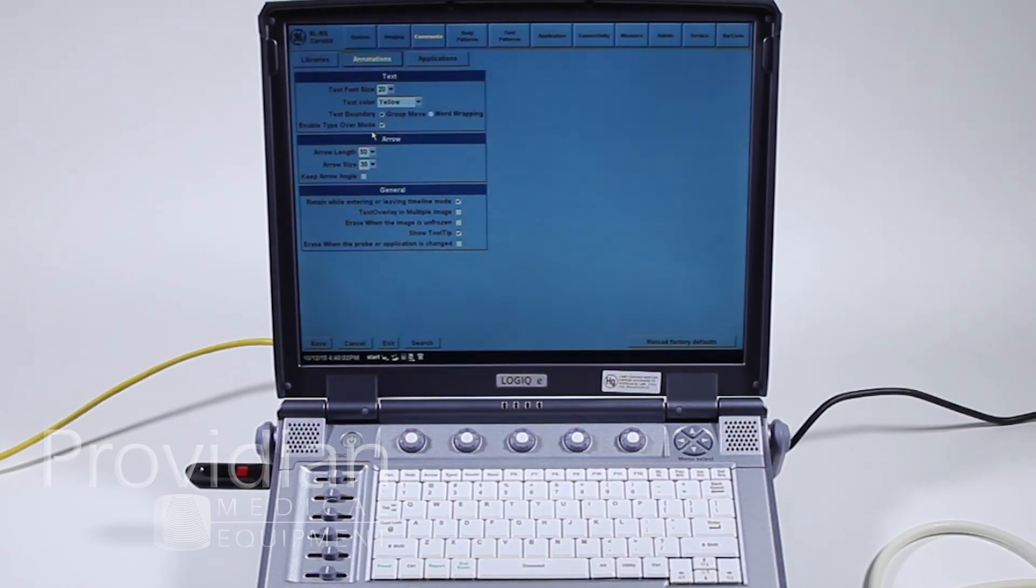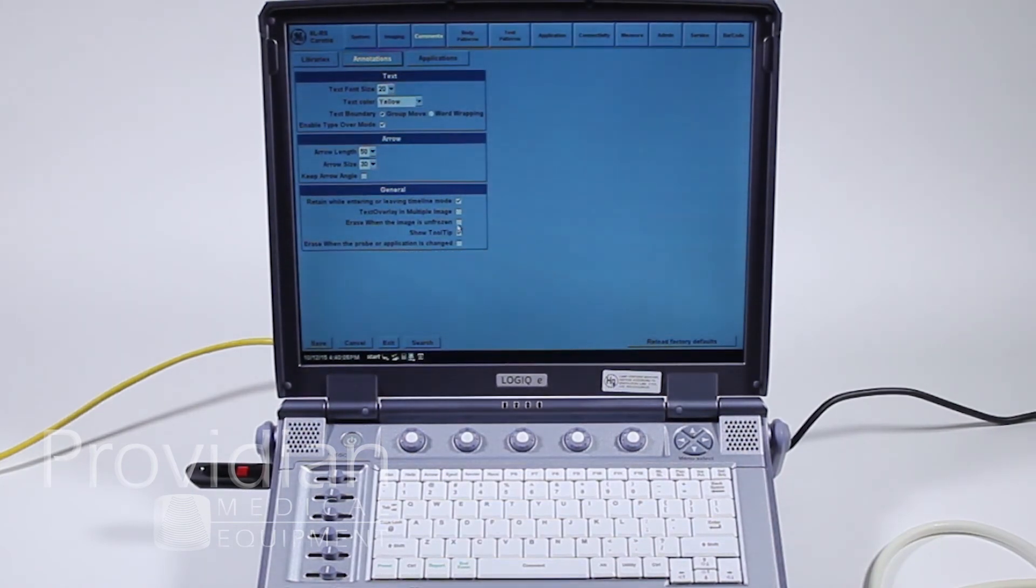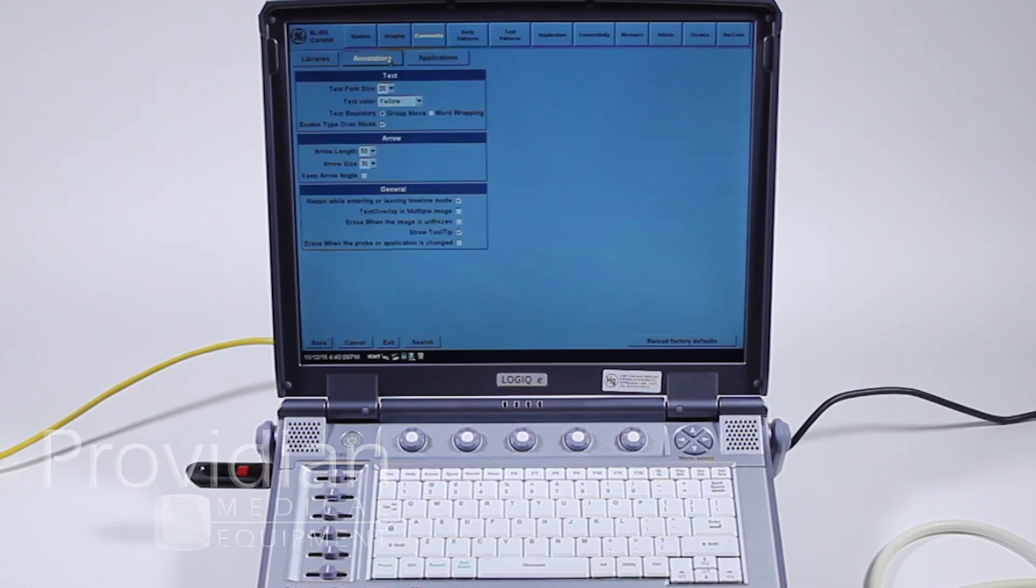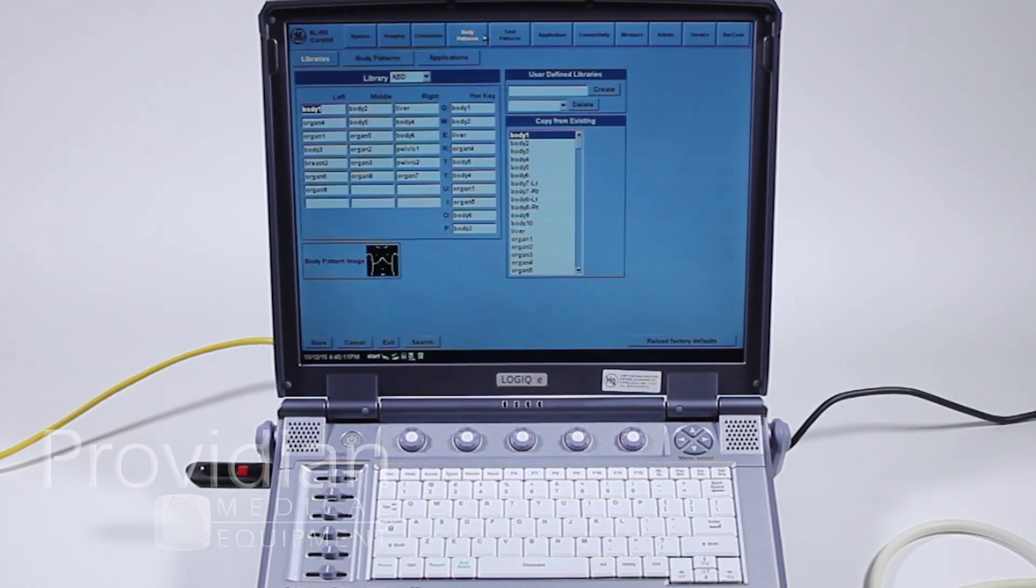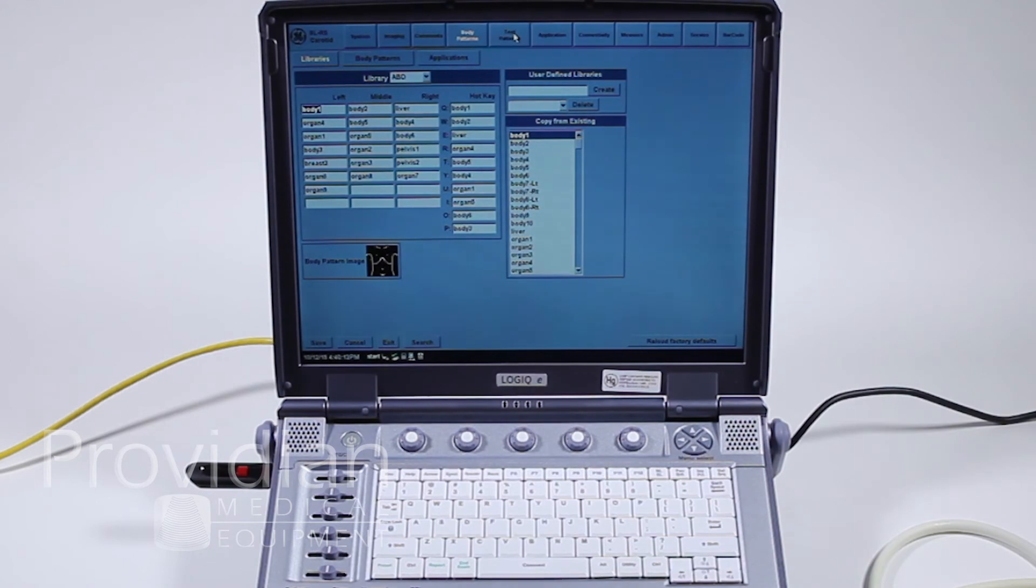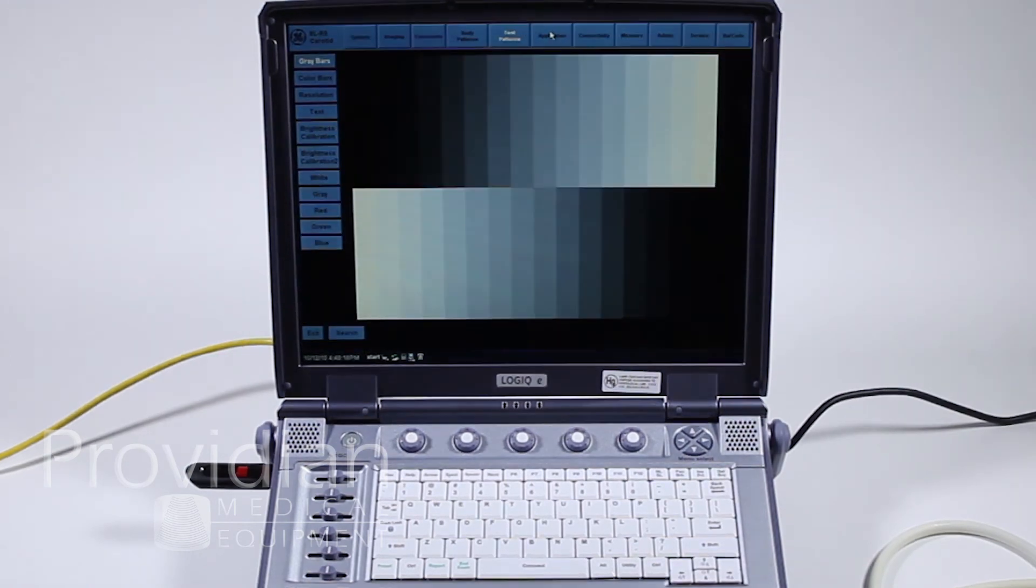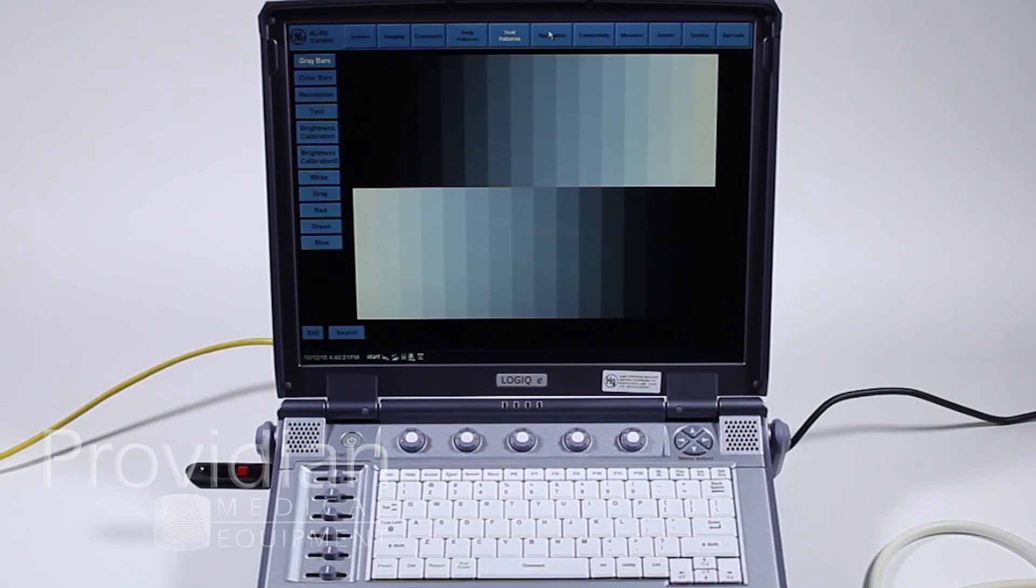Here's the annotations. You can adjust how the annotations appear on screen, changing the color, the text size. And then next we have our body patterns. I'm going to skip this since most people don't use them. Test pattern is really for the screen and for anyone who's working with the machine.